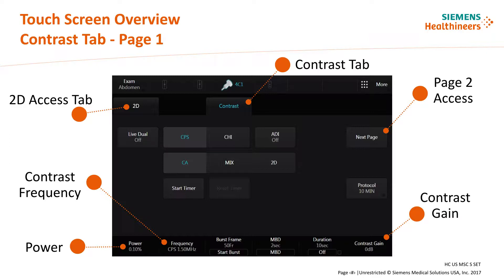There are two pages of contrast controls available on the touch screen. Page 2 is accessed by the next page key on the right side of the screen. Page 1 of the contrast tab contains the functions most often used during a contrast exam, as well as general scanning adjustments such as gain, frequency, and power output.